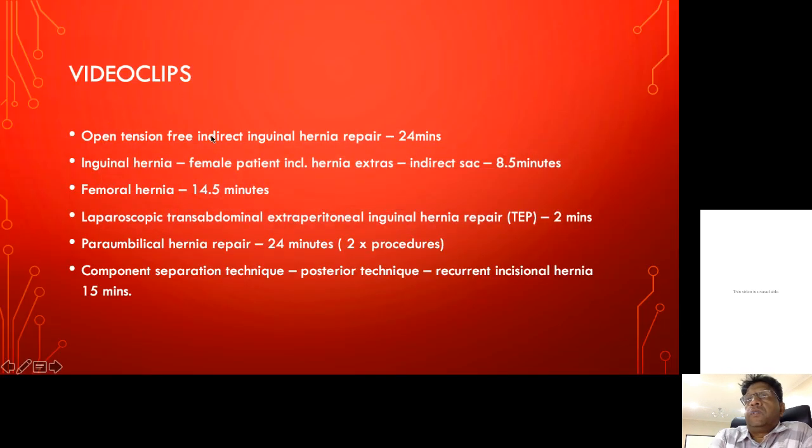If there's any questions, please post. That was a McEvedy approach to a femoral hernia, and very nicely shown. The femoral hernia is very difficult to visualize, and this was done very nicely. Good camera work. You could actually see the omentum inside the femoral canal, and then you couldn't actually see the inguinal ligament and the lacunar ligament, but he pointed it out, and you saw where the stitches went. If there's any questions, please post it to the group in WhatsApp.